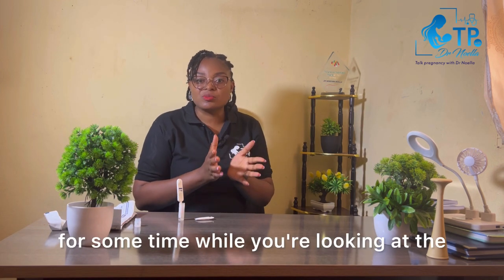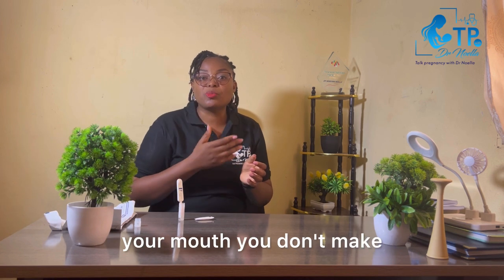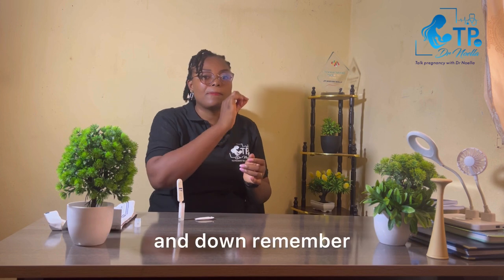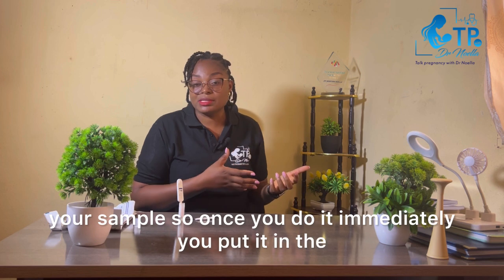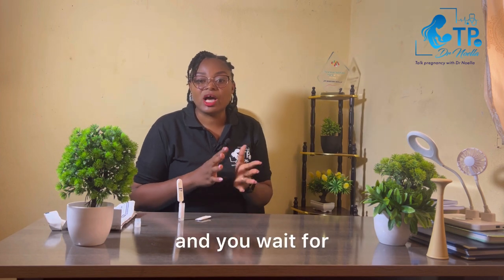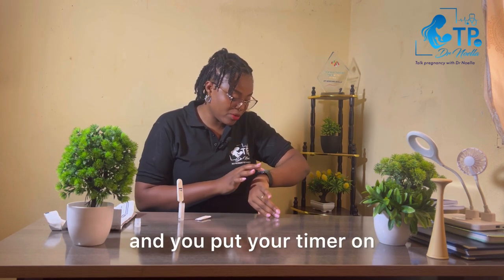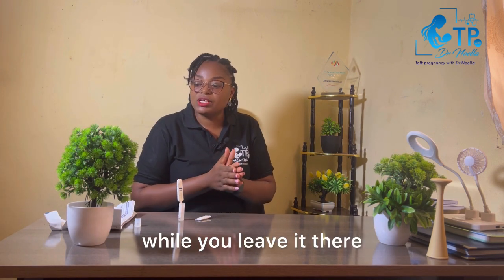Once you have swabbed your gums, insert the spatula immediately into the solution and leave it there. While it's in the solution, do not turn the spatula up and down — remember that air has bacteria and it can react with your sample. Once you've placed it in the solution, wait 20 to 40 minutes. Set your timer and you can go relax and do other things while you leave it there.